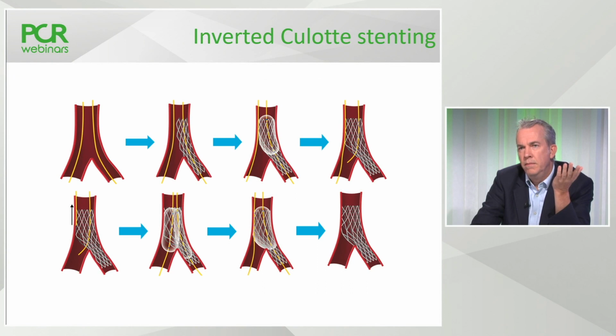Yeah. Can you lead us through the steps of this case? Sure. So it's definitely that you decided to do culotte, wire both branches, and then, yes, so you wire both branches.